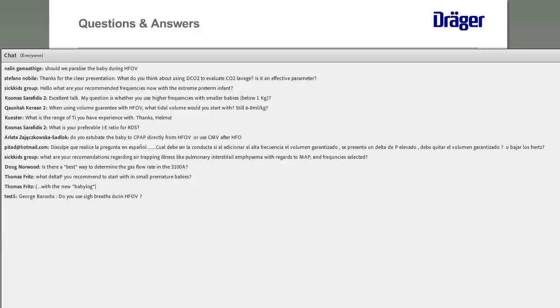In very premature babies, lower than 700 grams, we can ventilate them with lower than 1 ml per kilogram, and we can decrease delta P even to 15 centimeters of water. So try to know how much volume you are setting, and then decrease delta P as much as possible. In very preemie babies we begin at 20-25.